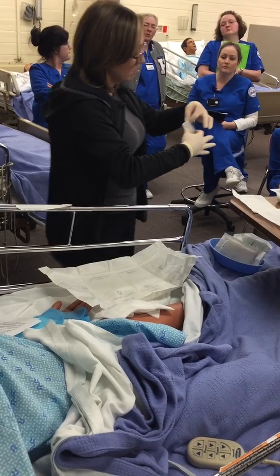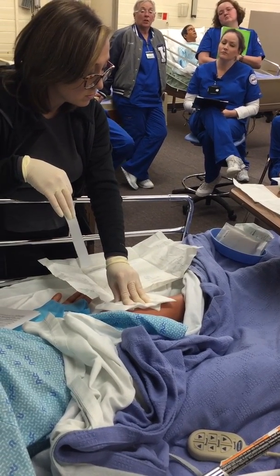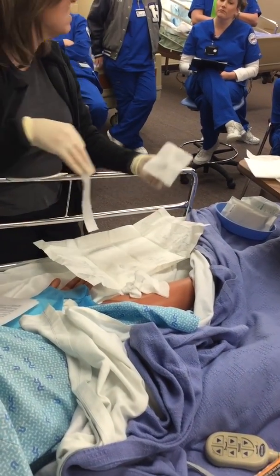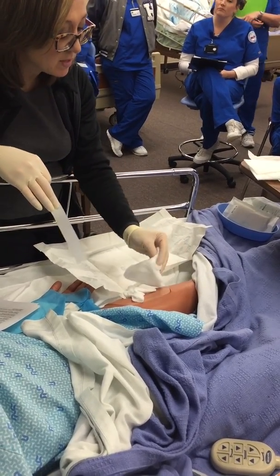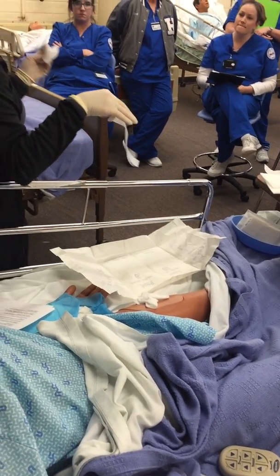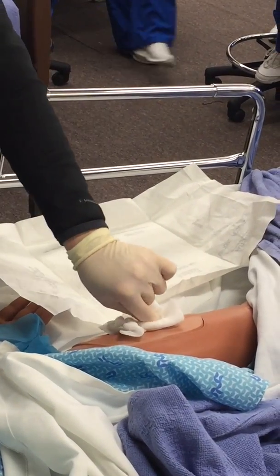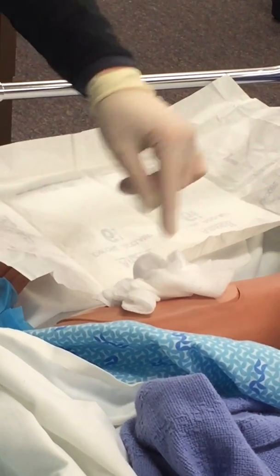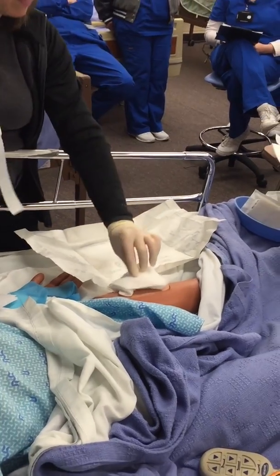If you touch his skin while you're putting that gauze in, does that break your film? If you touch his skin, yes. Okay. So like I said, when you're putting these on and you're packing them in there, if they're wet in the wound, they're going to stick. They're not going to be like on him. So you see how I bunch it up like that and I just put it directly onto him? I'm not actually touching in there. I'm touching the gauze to him. And then I picked this dry one up and put it over.